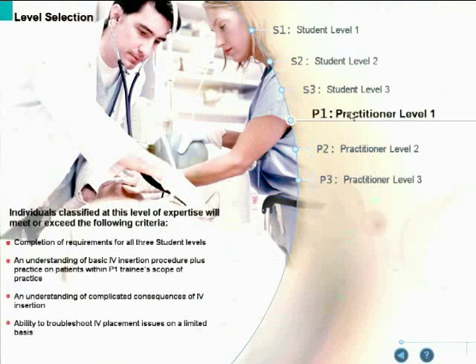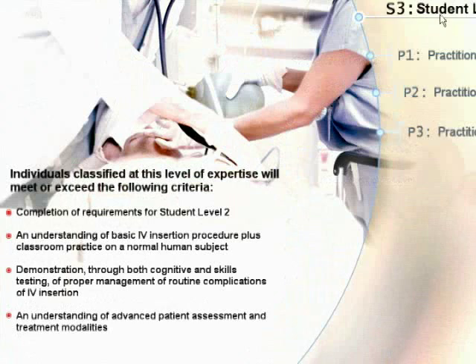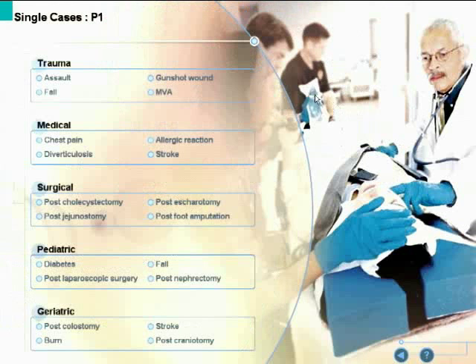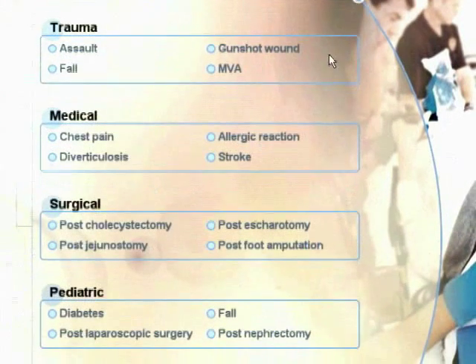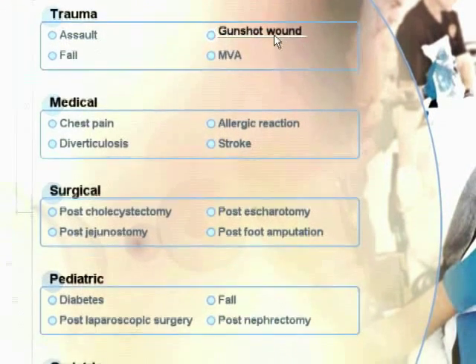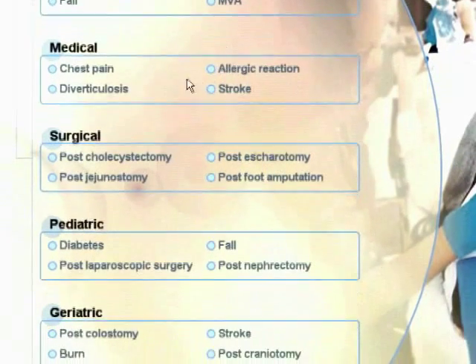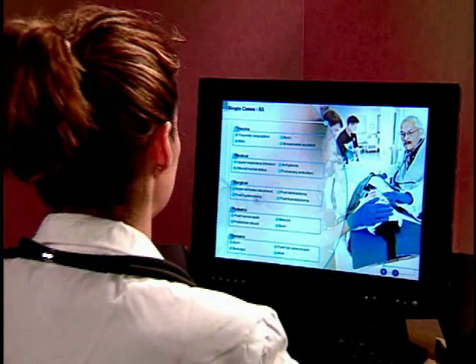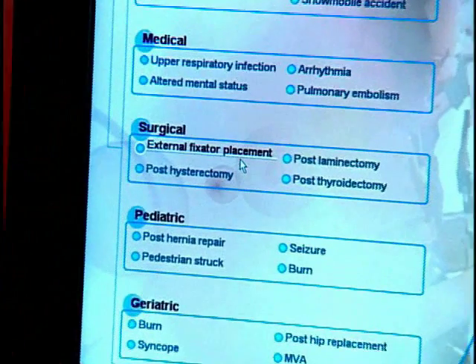When you rest your mouse on one of the levels, a bulleted list of criteria will appear on the lower left side of the screen. Once you select a particular skill level, you will transition to a screen containing 20 cases at that skill level, divided into trauma, medical, surgical, pediatric, and geriatric care specialties.